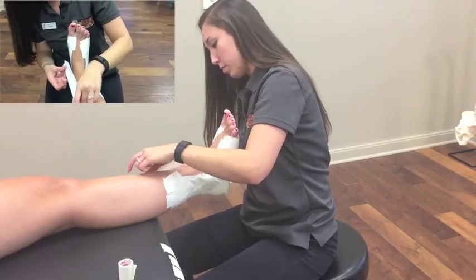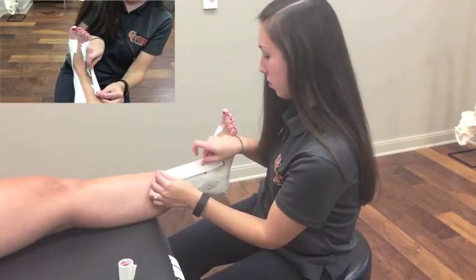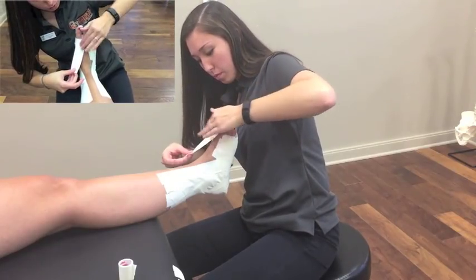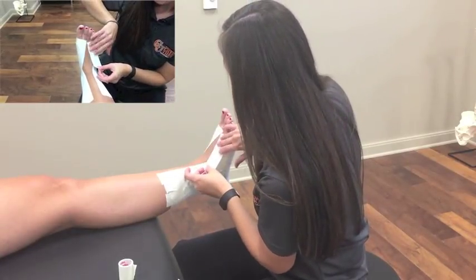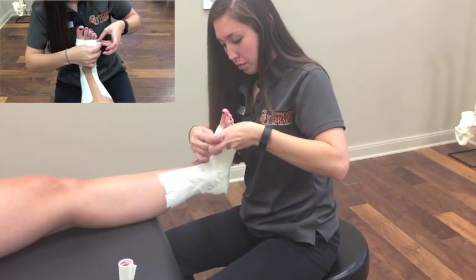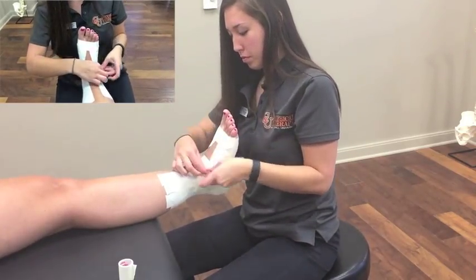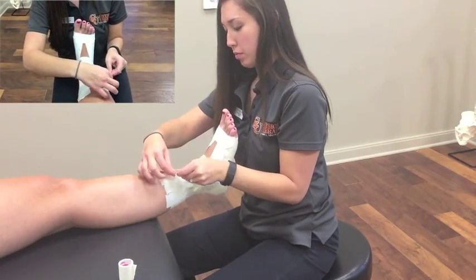Now you want to place anchor strips to the anterior leg and dorsum of the foot at the edges of the previously placed tape. Apply three horizontal strips: one across the foot, another across the ankle, and the last across the leg. Make sure to fold over a flap on each piece of tape to allow the patient to remove or readjust the compression each strip is applying.